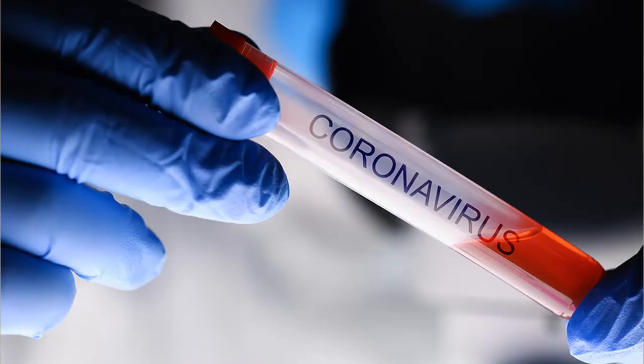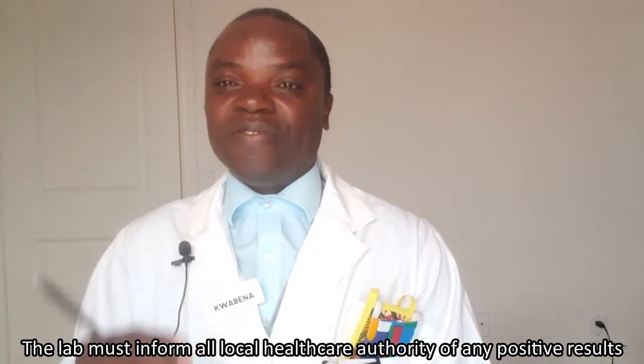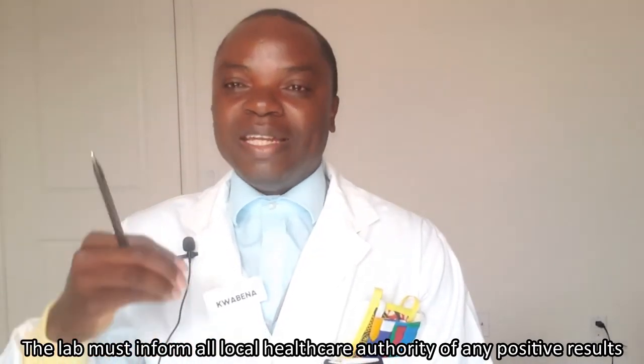So the next step here is when the results are transcribed, it goes into a report. And if positive, the MLT must notify the ordering healthcare provider and also the local health authority immediately. So once somebody tests positive for coronavirus, we don't just stop there. The next step is to pick up the phone and call the patient's physicians to let them know that this individual tested positive. And also the next step is to call the ministry within the locality to let them know that we have a patient who has also tested positive for this coronavirus. Those are all extra steps that a medical lab technologist must do.